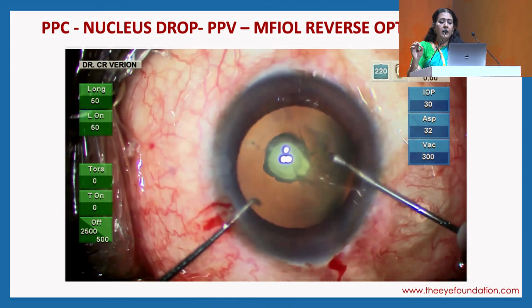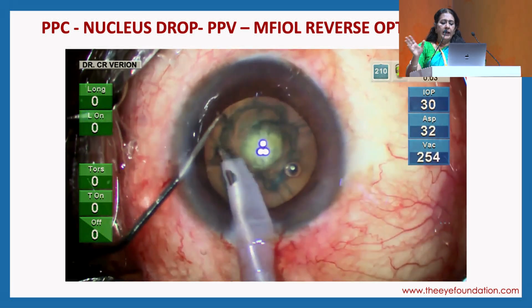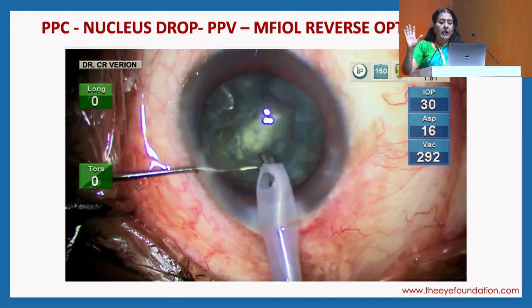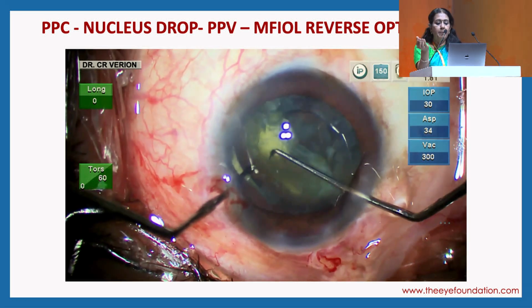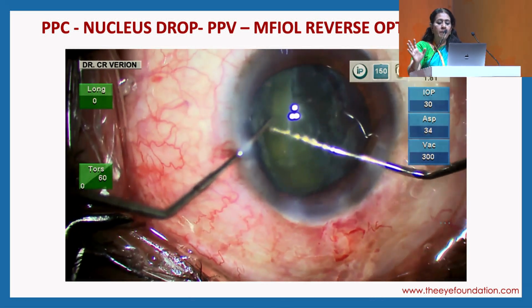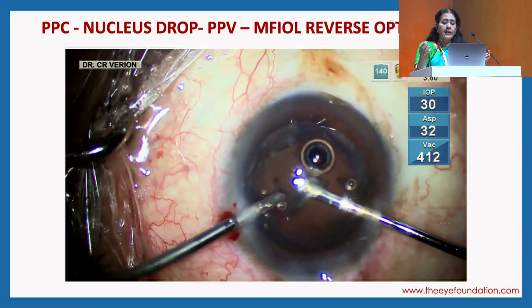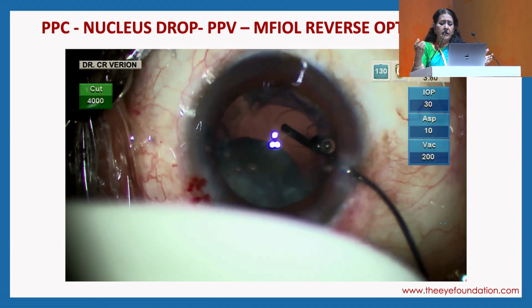Now this is again another polar cataract. Now I do my hydrodelineation, and I sort of debulk the epinucleus, but suddenly I slow down, like it was going at a fast rate. I normally don't operate that fast. But then I realized that some sinking thing is happening, so I immediately realized that the PCR has opened up, and I was lucky in this particular case that the epinucleus came out very easily, so I start removing it, and then do an anterior vitrectomy and remove the cortex.